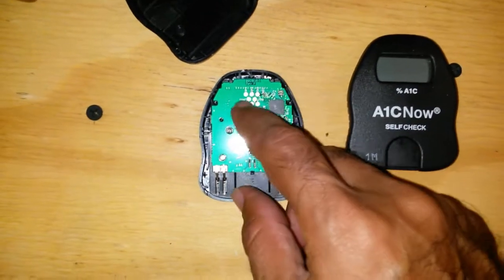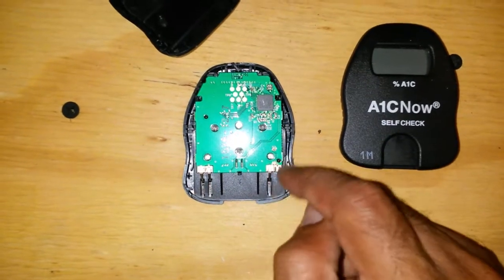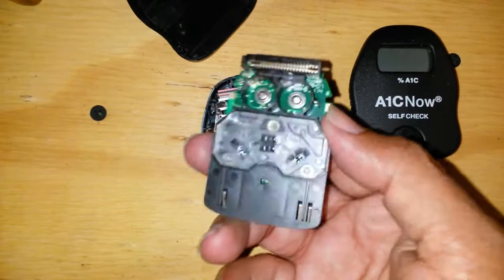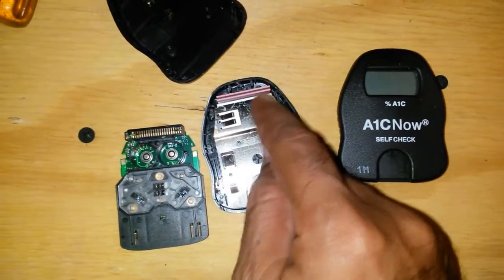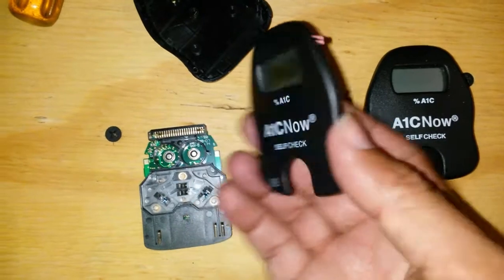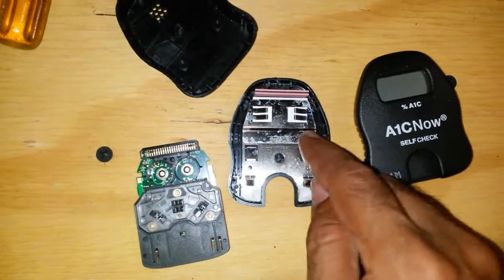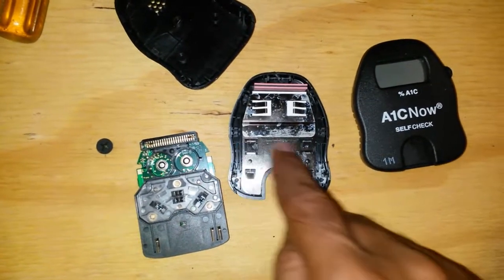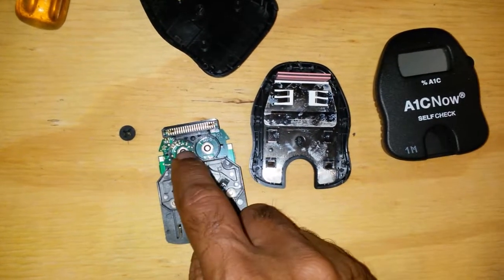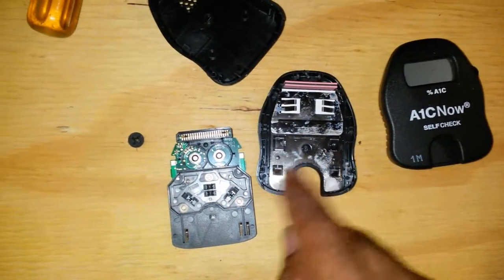So first thing, set of test pins, BGA package, not bad, pretty small traces and contacts. Again, medical device, so as you would expect, pretty well done. Right. The zebra cable, little zebra rubber to join onto the front here for the screen. It's been a long while since I saw one of those, but I guess it's one cheap way of doing it. Two contacts coming down. Those are the two battery positions. So that side will be the negative, and that will be on the board, and positive coming back, feedback into the system.